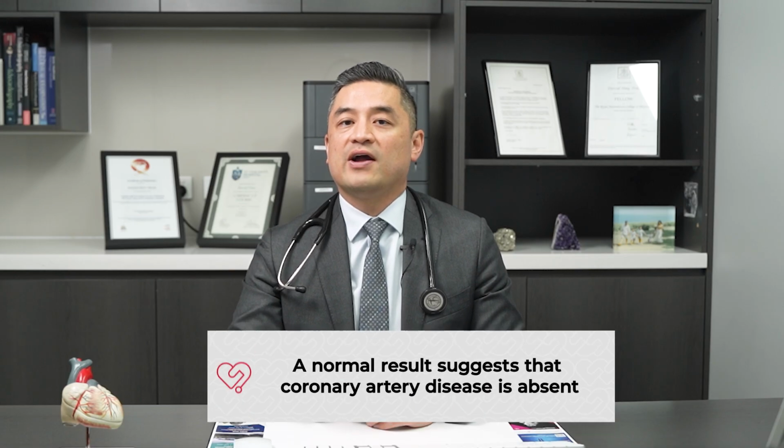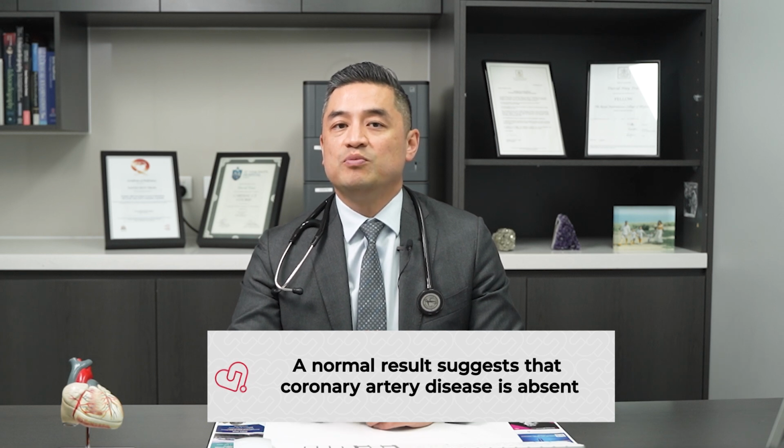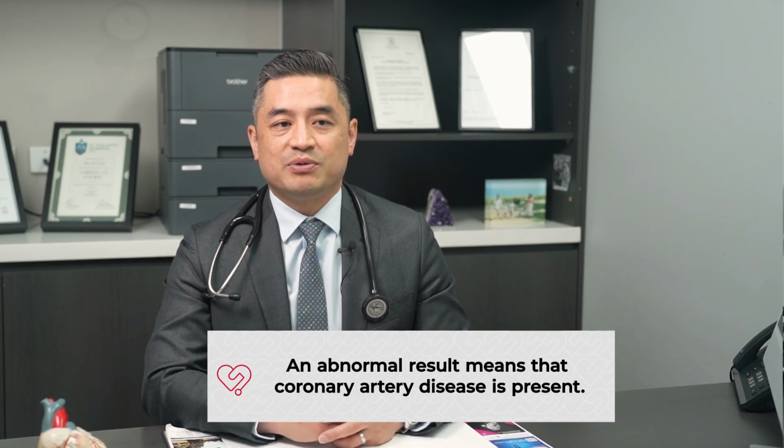A normal cardiac CT scan will have no evidence of calcium deposition, and there'll be no evidence of coronary plaque. This suggests that coronary artery disease is absent or so minimal it can't even be seen by this technique. The chance of having a heart attack over the next 5 years is very low in these circumstances. On the other hand, an abnormal test means that coronary artery disease is present. The location of the plaque, the nature and severity of the plaque will help your doctor create a personalized treatment plan to manage your heart health. This might include lifestyle changes, medications, or further testing and procedures if necessary.